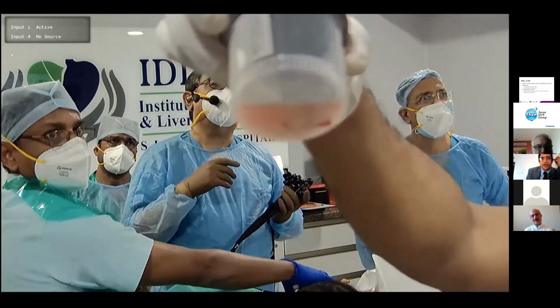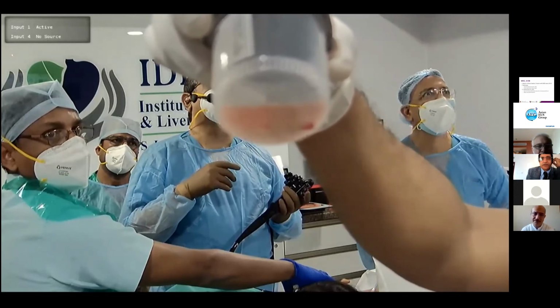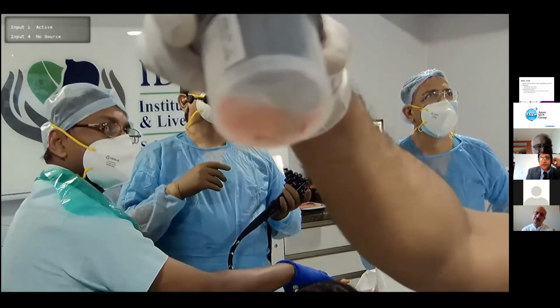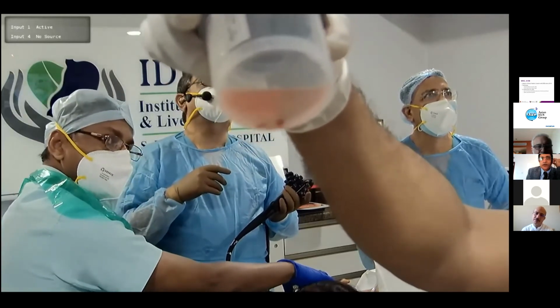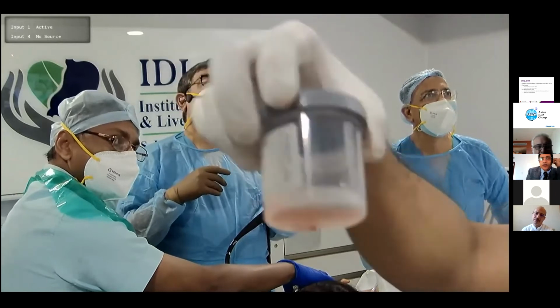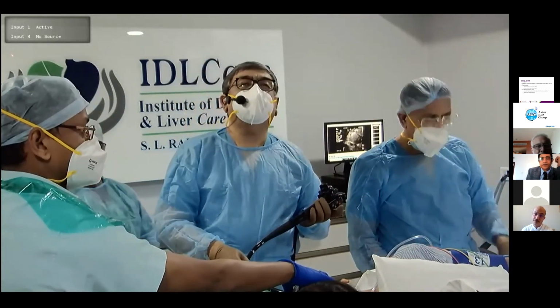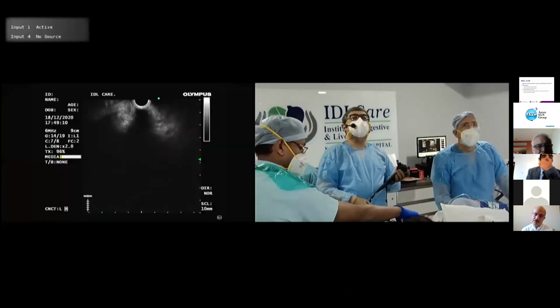Yeah, we can see some tissue. Yeah. There are 2 core pieces there. Yeah. Thank you, Rahul. Looks good. Yeah, we can see a core down there at the bottom. So one biopsy is enough. In this case, we don't need to take any more biopsies.